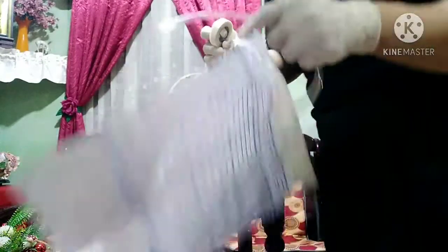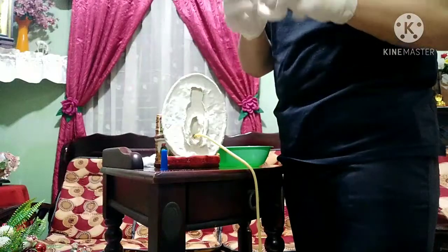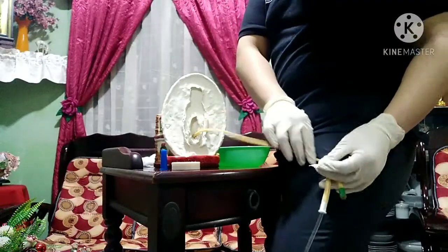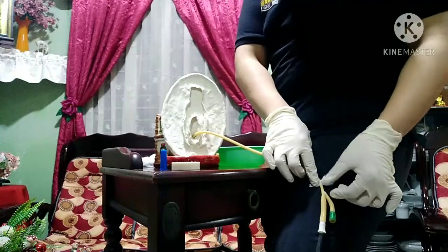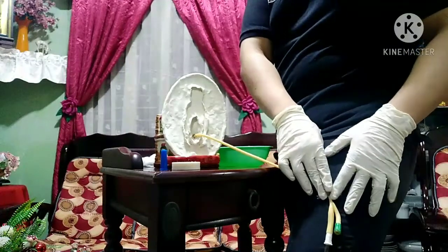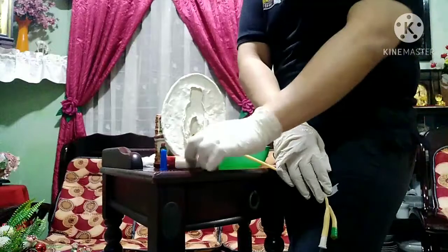So, ito po, kukuha po tayo ng micropore tape natin. Tapos, for example po, ako po yung patient. So, ito po yung catheter. I-tape lang po natin po, para lang po hindi po maalis. So, ayan po. Mali po.